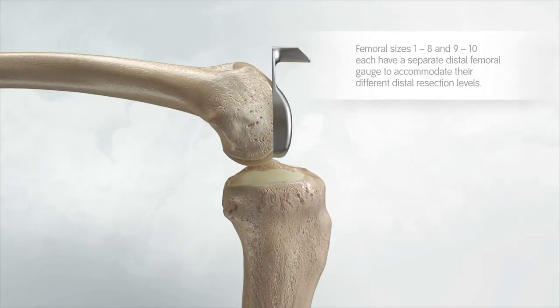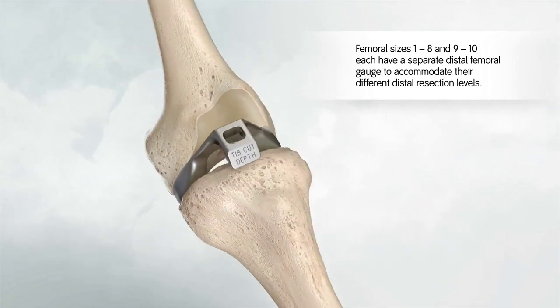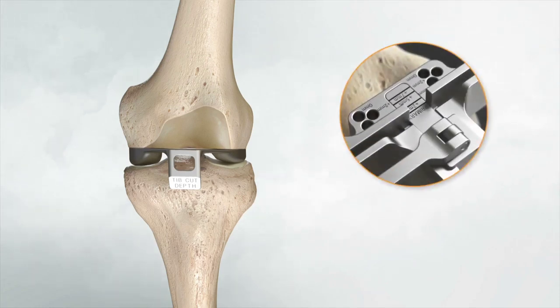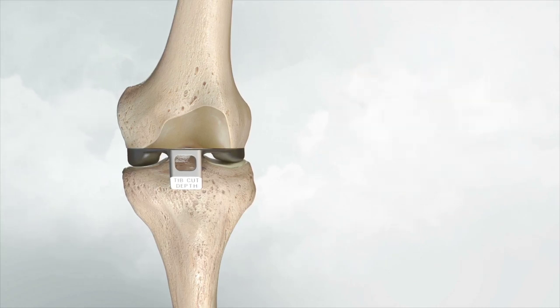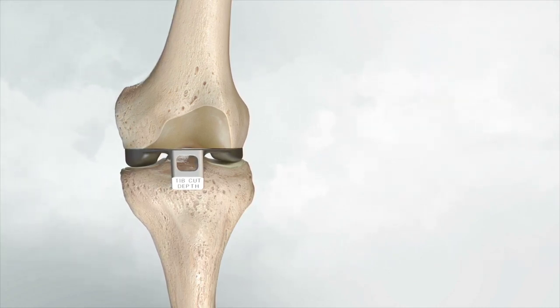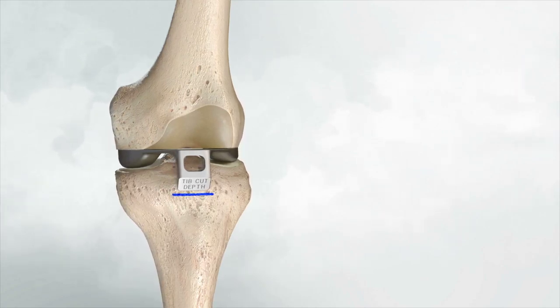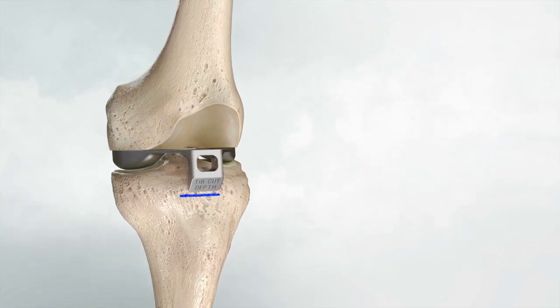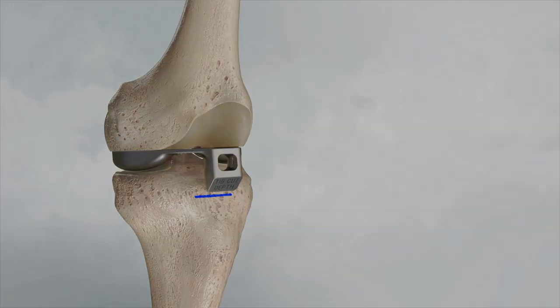Place the distal femoral gauge on the resected distal femur and bring the knee into extension. If the knee achieves terminal extension, proceed without recutting. If not, shift the distal cutting block 2 mm and recut. With the distal femoral gauge in place and the knee in acceptable terminal extension, mark the anterior tibia as an initial depth estimate for the medial tibia resection. This is just an initial starting point and will require fine-tune adjustment with a stylus at the tibia preparation step.